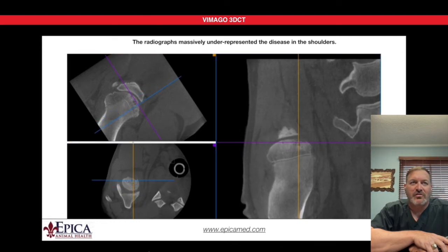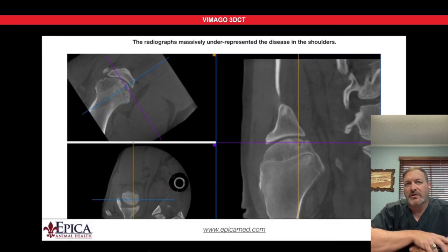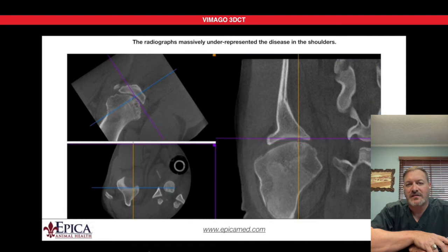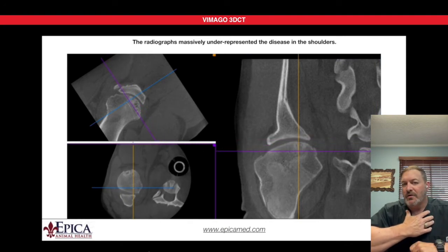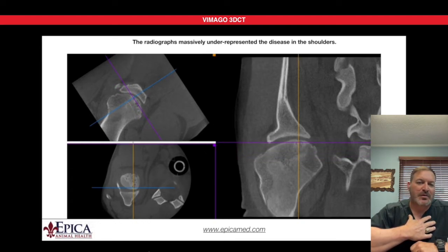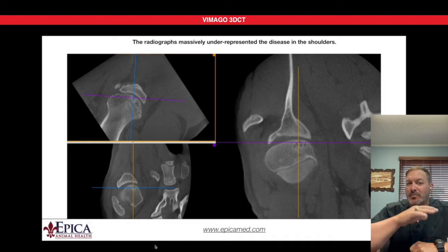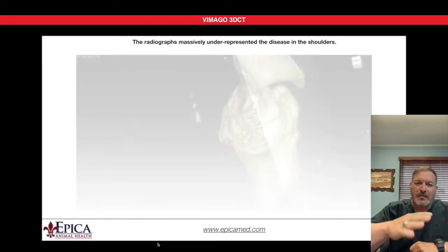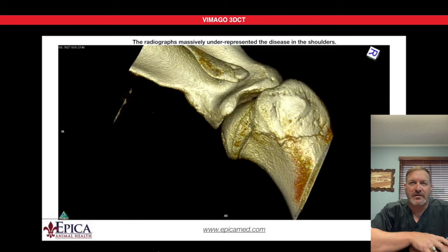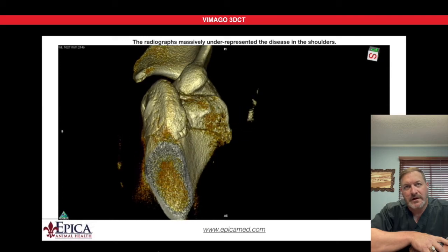And as the 3D shoulder joint turns, you'll be able to actually see through some parts of this shoulder. And this is genuine proof that we're just missing things with radiographs. It's not our fault most of the time. It's just a limitation of the plain film or plain digital technology. Plain is in PLANE. The plane is only one when we need to have multiple planes looked at. So here's the 3D image. And as it rotates around, you'll be able to look at the lateral aspect of this joint and see right through it, right there.